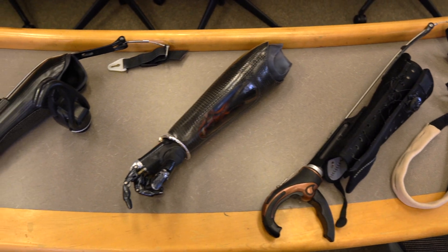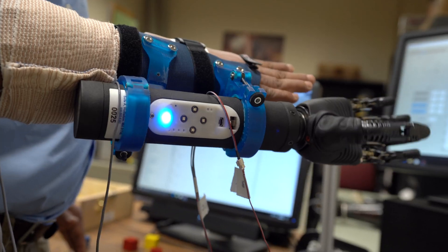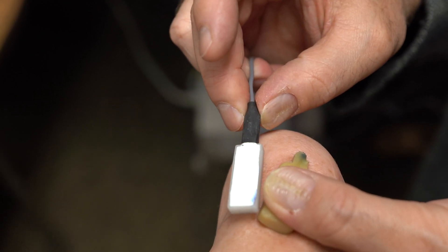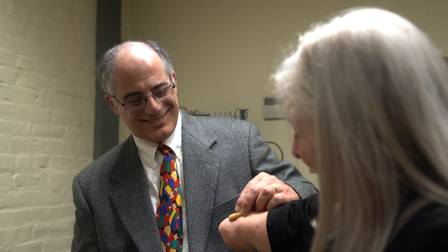Existing prosthetics place sensors in the socket of the prosthesis and use those to control the hand or the wrist. But some of the newer generation of prosthetics can be socketless, so they no longer have a place to put these electrodes and sensors. We're developing these sensors in a wireless form so they can be placed directly on the arm and communicate wirelessly to the prosthesis.